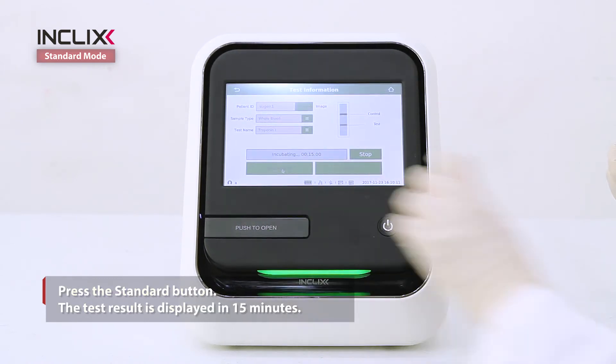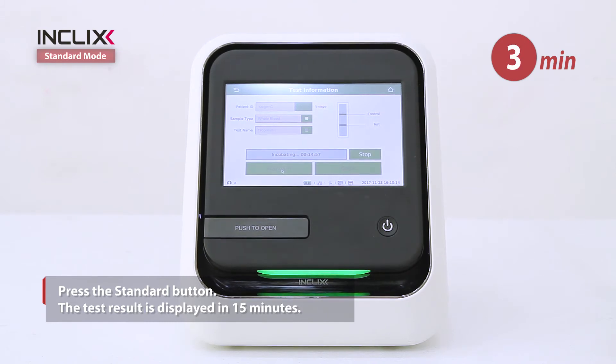Press the Standard button. The test result is displayed in 15 minutes.